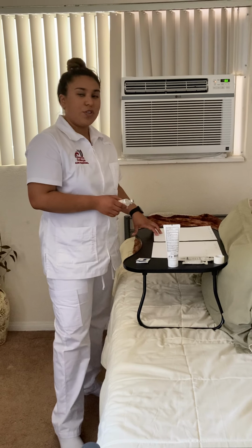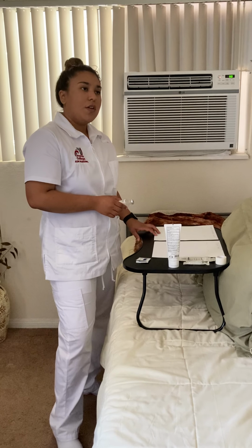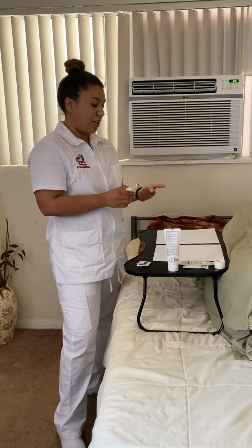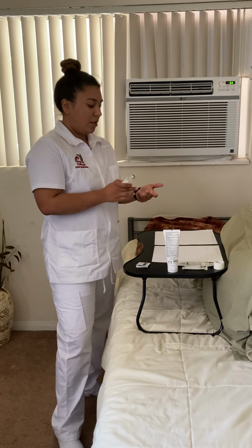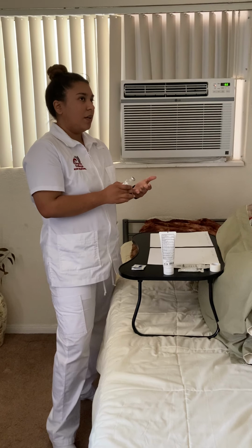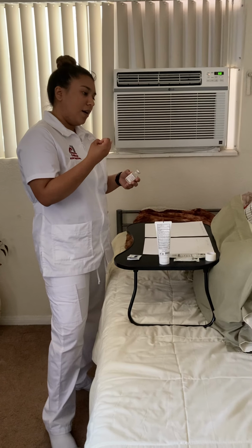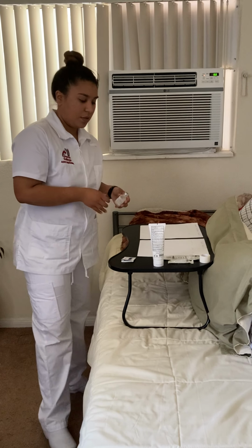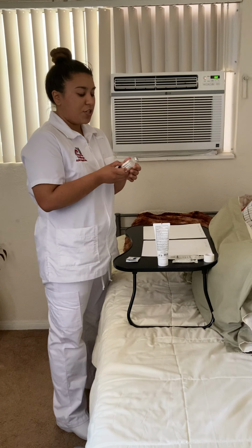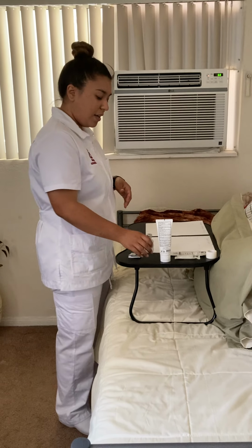So this would be the first check, and I would also want to observe the 7 patient rights. So that would be the right patient, give them the right drug at the right time, via the right route, in the right dose, for the right reason, with the right documentation. Okay. So I also want to check the expiration date. So this says the 1st of July 2021, so that's okay.